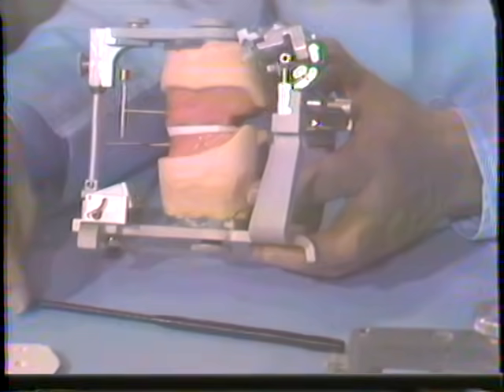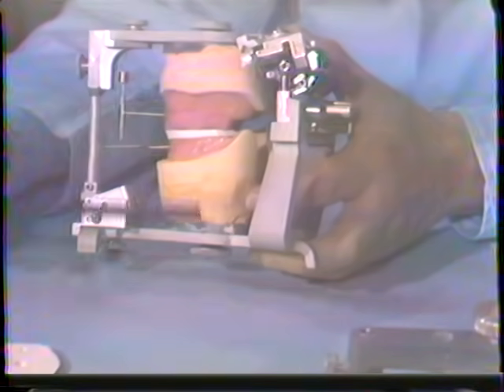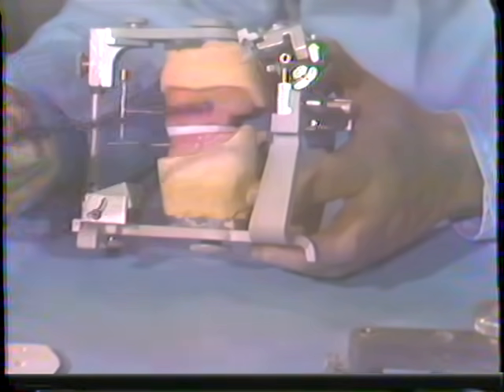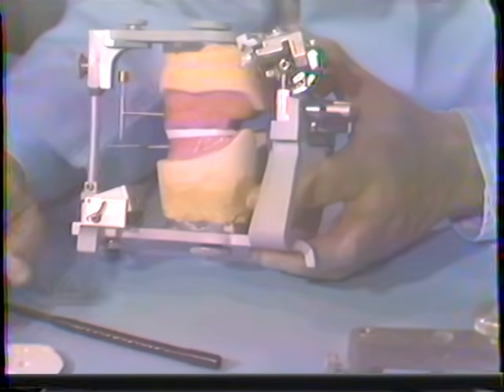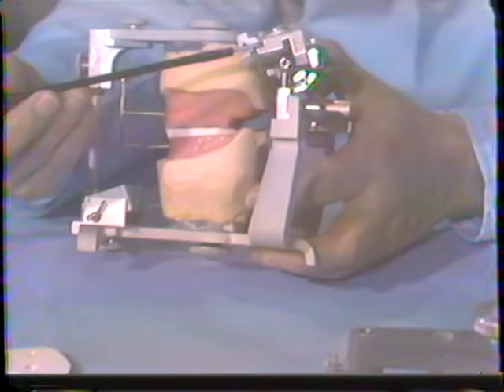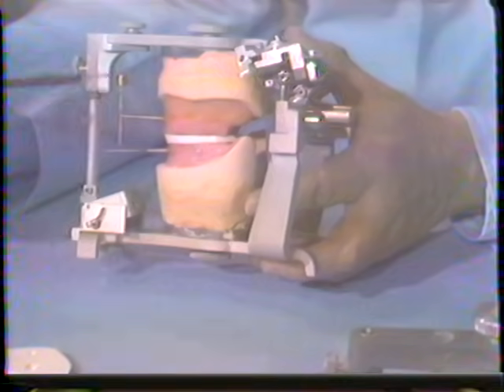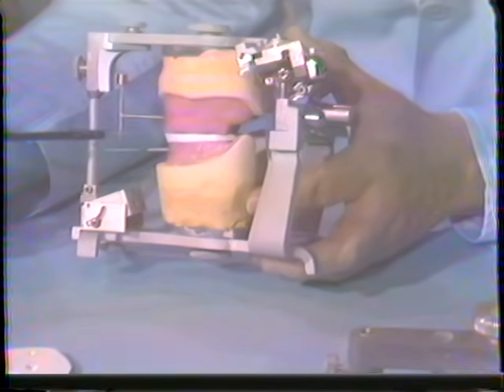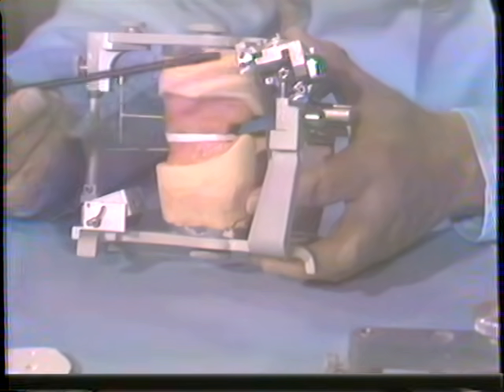And hence, there are a multitude of instruments now available which have this arcon design incorporated in rather simple instruments. It's not a new concept, this arcon design. It dates way back in more sophisticated, more complicated instruments, to the 1920s. The earlier ones were actually of an arcon design.